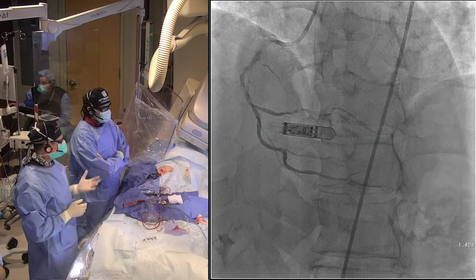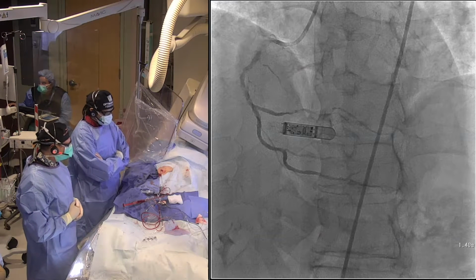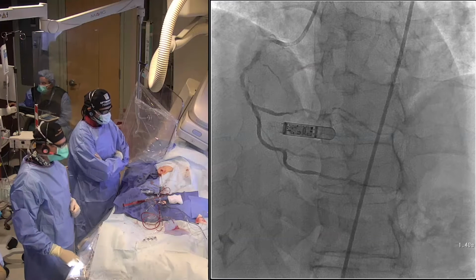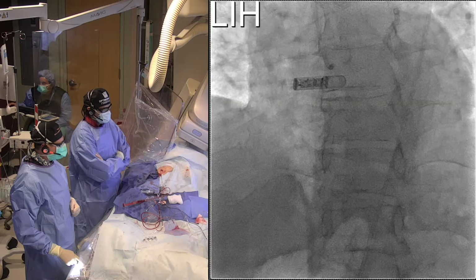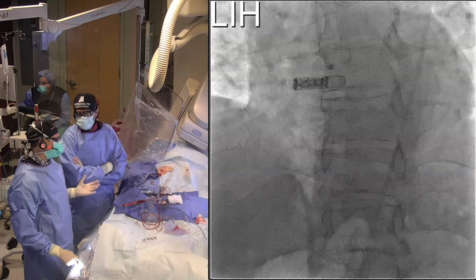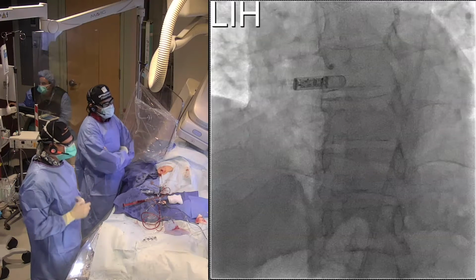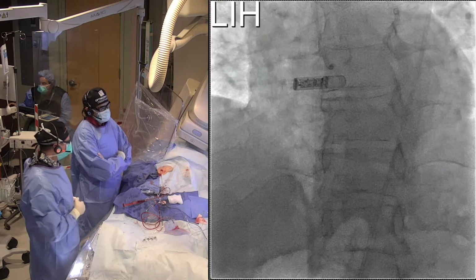today. He has pretty diffuse disease of the RCA, maybe two focal lesions, proximal and mid, and then diffuse disease of the RPL. The left system has been stented in the past, both the circ and the LAD, both of which are open. Well, I put them in. You did it. The only problem is he has a 90% ostial lesion of a diagonal, which we're not sure if it's significant or not.